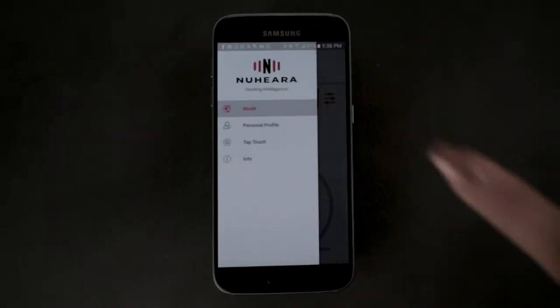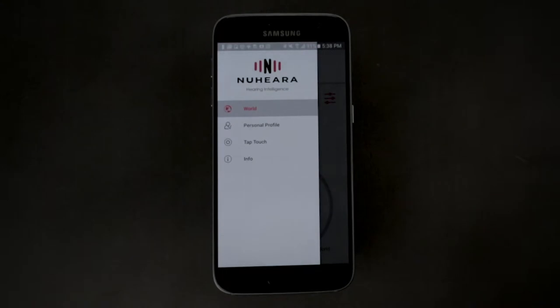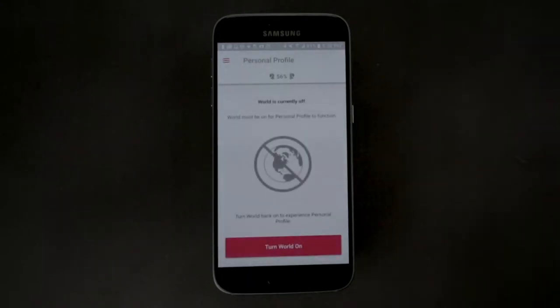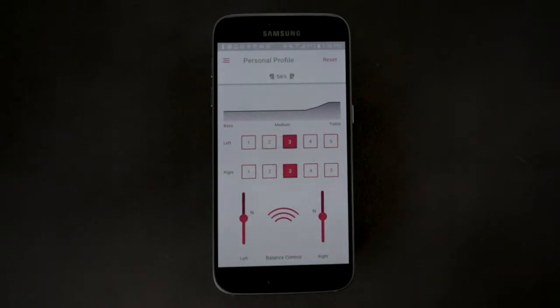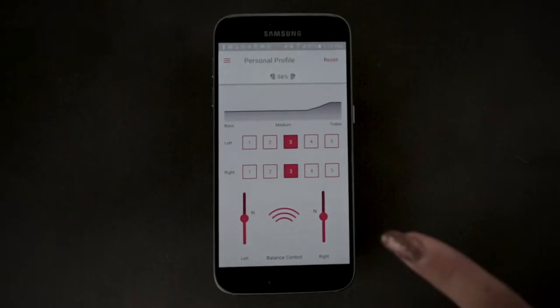You can get to the personal profile screen by clicking the menu icon in the top left of the screen. The default profile is set to 3. There are 5 settings to boost different frequencies for your left and right ears separately. It is important that you choose the setting that most closely matches your hearing requirements.